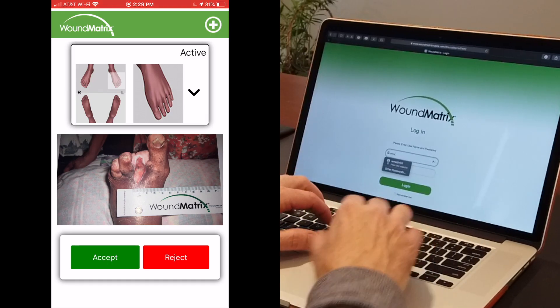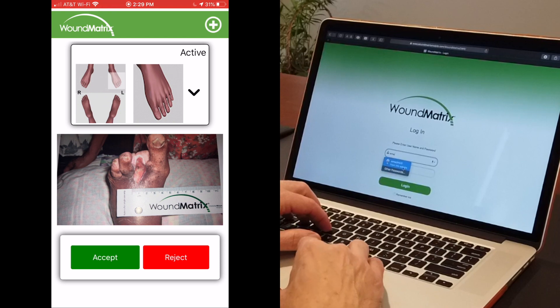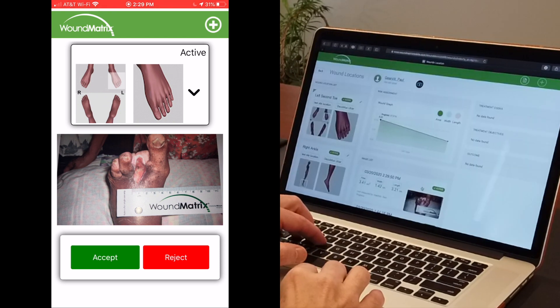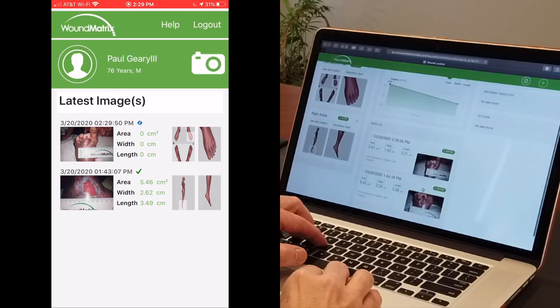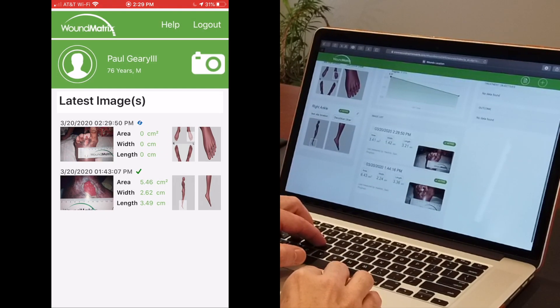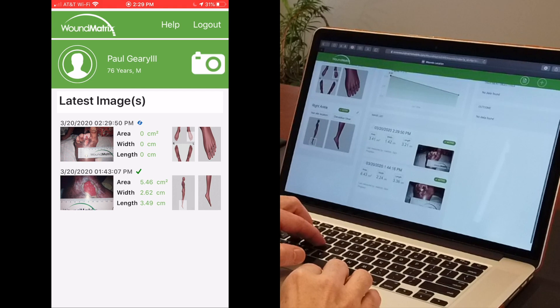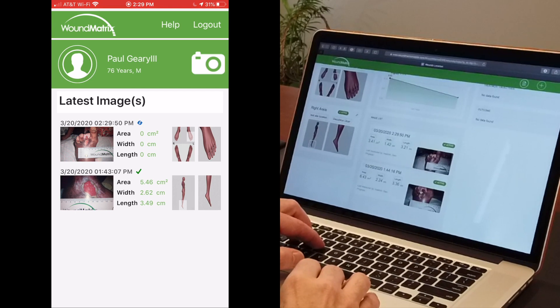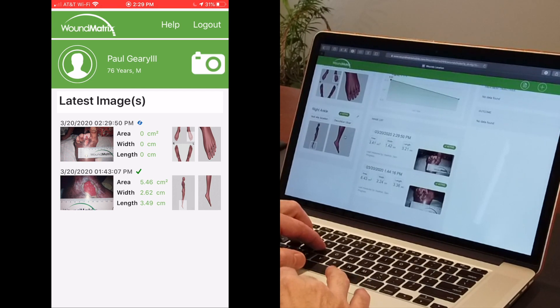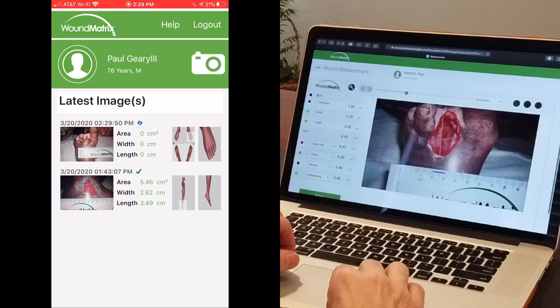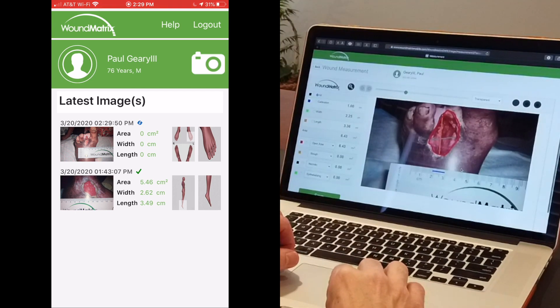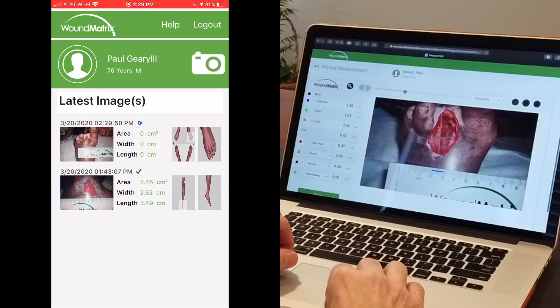Wound Matrix Patient is a telehealth solution that enables patients to capture pictures of their wounds at home using their mobile phone or tablet, and immediately share those images with caregivers for remote wound assessment and measurement.